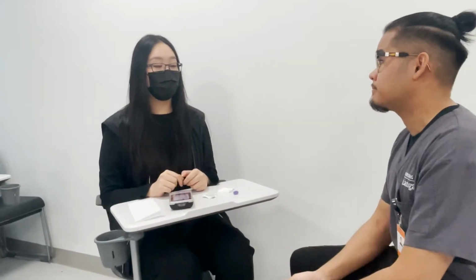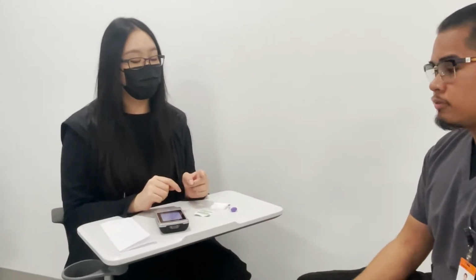Alright, so now that you got the strip in, what's the next step? I'm gonna choose a finger and then clean it with alcohol. Okay, perfect. And I'll just choose the one on the side. Just on the side? Okay, yep, that's exactly right.